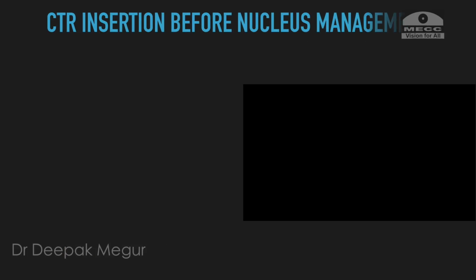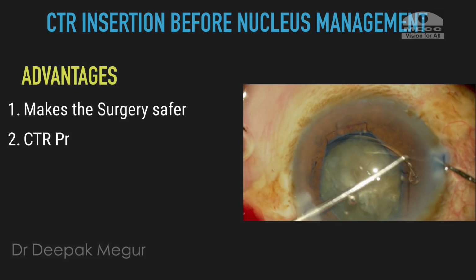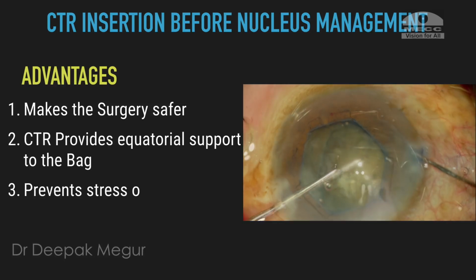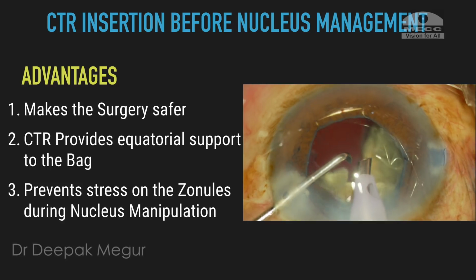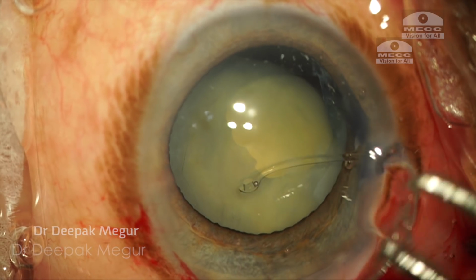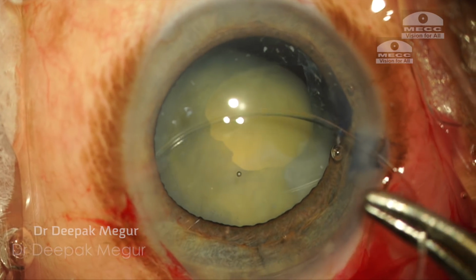When we implant the CTR before nucleus management, it makes the surgery safer by providing equatorial support all around, and the CTR ensures that the zonular stress is minimized during nucleus manipulation. I prefer earlier introduction of the CTR when the situation demands, rather than postponing it.